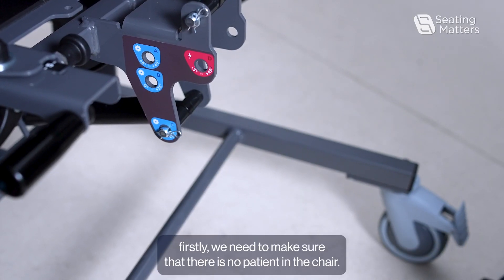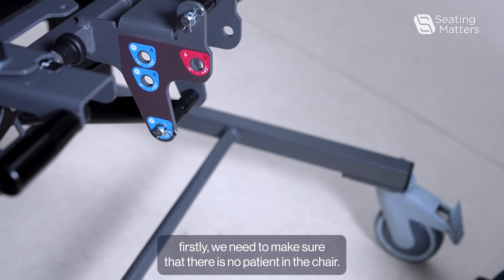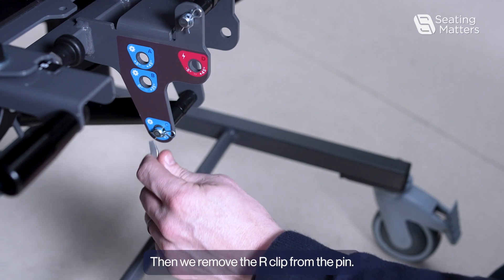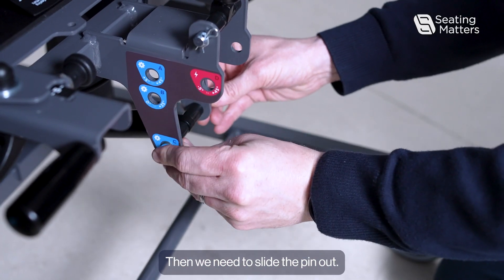To adjust the angle, firstly we need to make sure that there is no patient in the chair. Then we remove the R-clip from the pin, and then we need to slide the pin out.